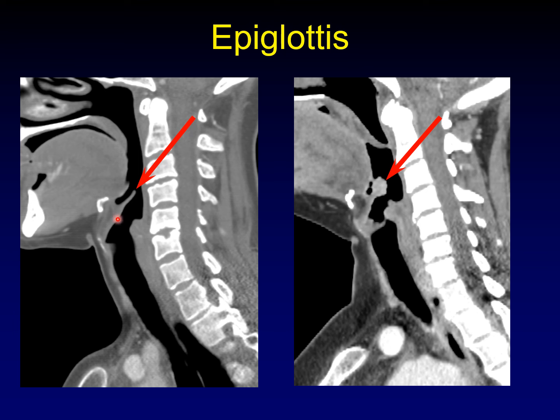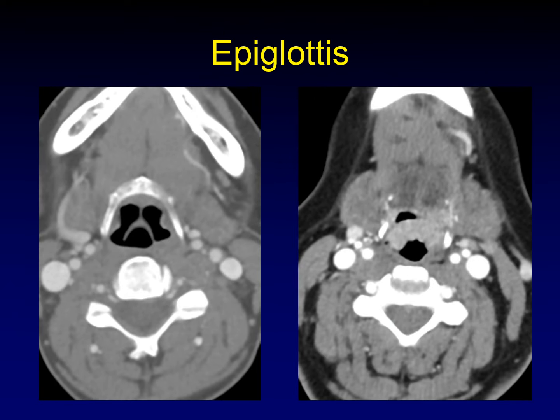If this is the normal size of the epiglottis — just a thin object sticking up — here's what the epiglottis looks like when it becomes thickened and affected by cancer. This is a cancer exclusively within the epiglottis, with no spread down to the rest of the larynx. Here's what this looks like in the axial plane: the epiglottis is supposed to be a thin line sitting in the oropharynx, but look how thick it is when infiltrated by tumor. It has the same configuration as the normal epiglottis, but is way too thick and way too enhancing.